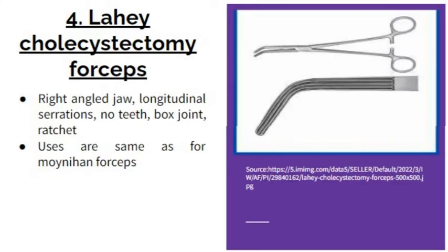The next one is the Lahey cholecystectomy forcep. It has a right-angle jaw — it is not curved but has a specific right angle. It has longitudinal serrations, not transverse. These two features make it different. Like Moynihan, it is angled, but different from Moynihan in that it has longitudinal rather than transverse serrations.